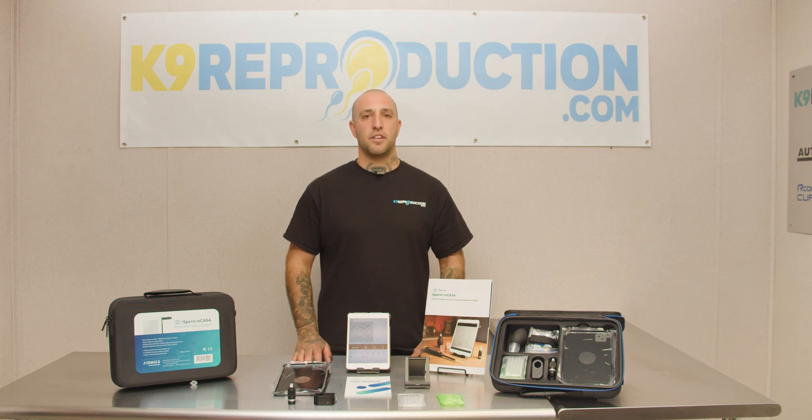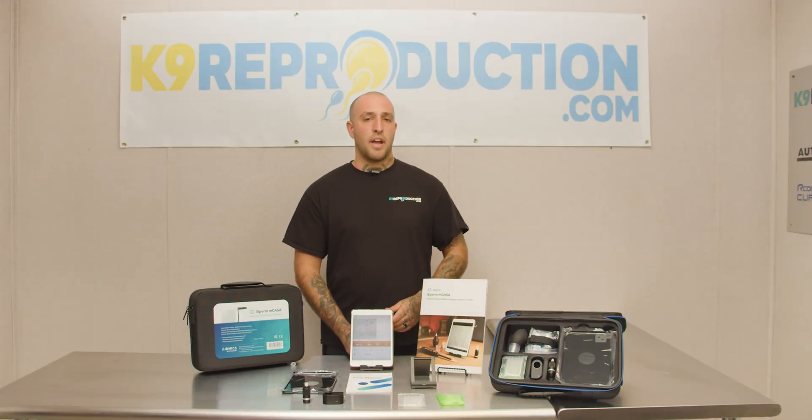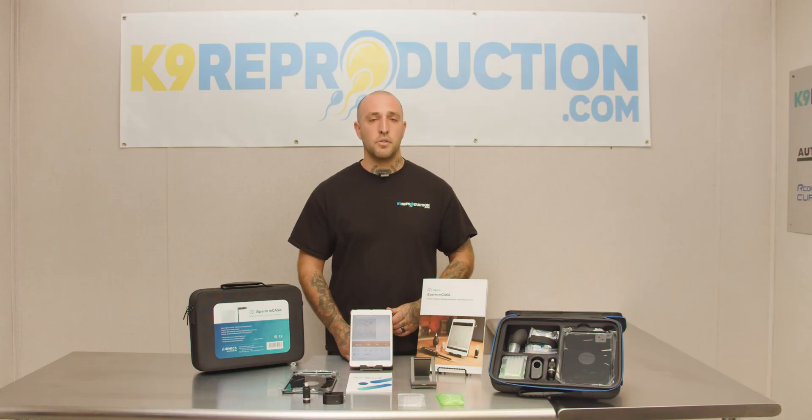Hey guys, this is Travis at K9reproduction.com and we're going to talk today about the Aidmics iSperm system. The Aidmics iSperm is fast and efficient and highly compact. The entire system fits inside of this handy little carrying case, so whether you're in the office or on the go, this system is going to be great for you and your business.